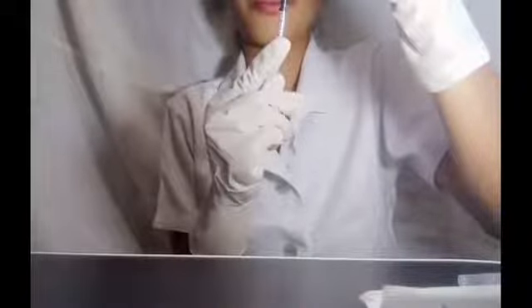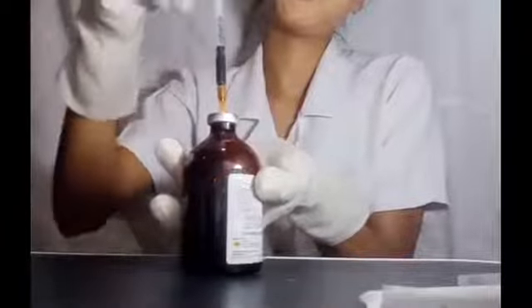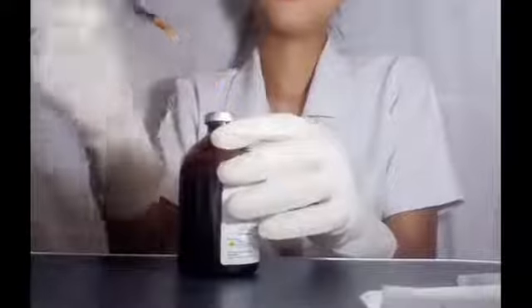So we have here 0.3. And now we are ready to do our intradermal injection.